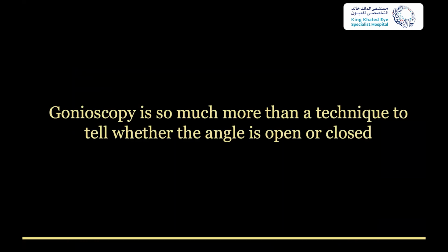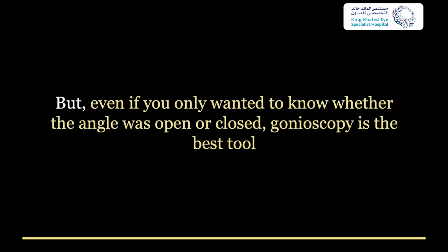So I show you all these videos just to get you excited that, man, gonioscopy is pretty neat. You get to see some amazing pathology and really cinch the diagnosis in many cases. So it's so much more than just a way of saying that the angle is open or closed. But even if that's all you wanted to know, it's still the best tool.